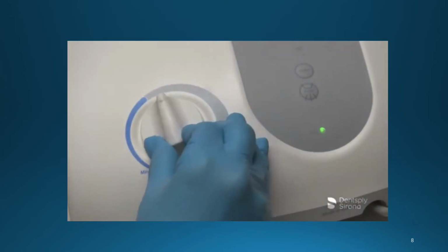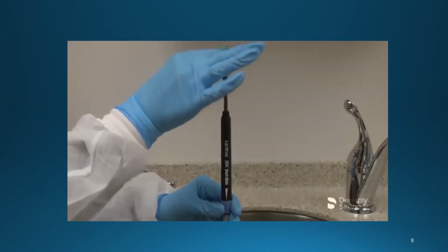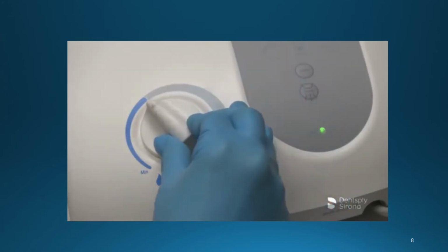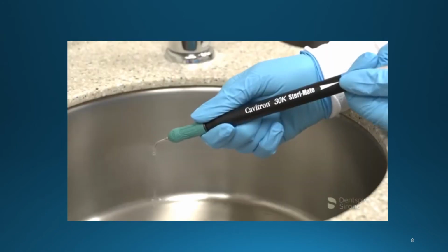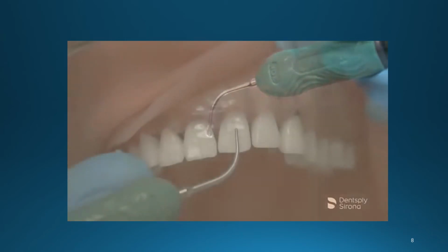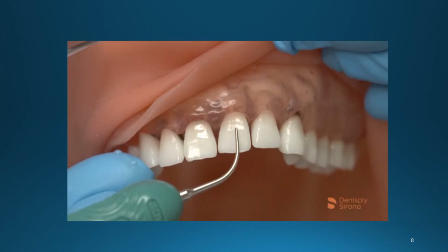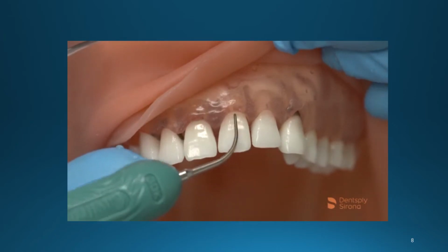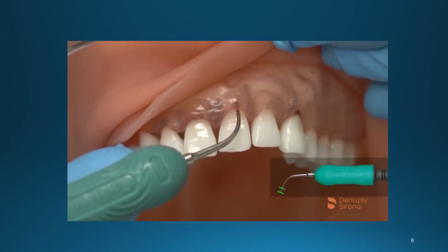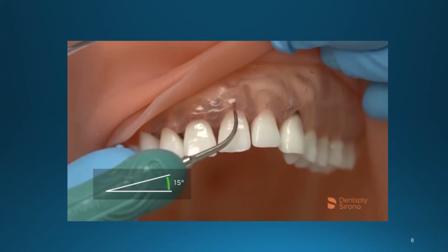power levels. After the clinician has filled the handpiece with water, seated the insert, selected the power, and adjusted the spray properly, instrumentation begins according to the treatment plan prescribed for the patient. The clinician will adapt either the lateral or back surface of the Cavitron FSI Slimline 10 to the clinical crown and float towards the gingival margin, maintaining 2 to 3 millimeters of adaptation and a 0 to 15 degree angulation.